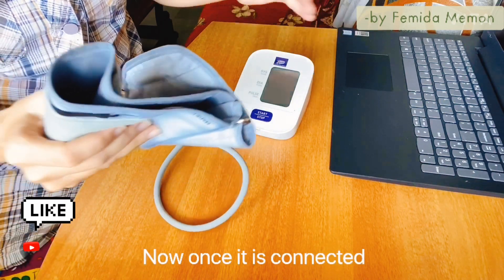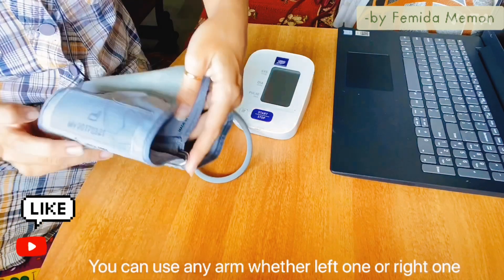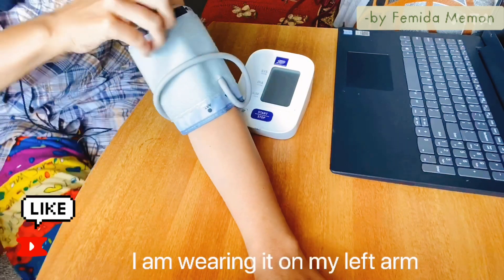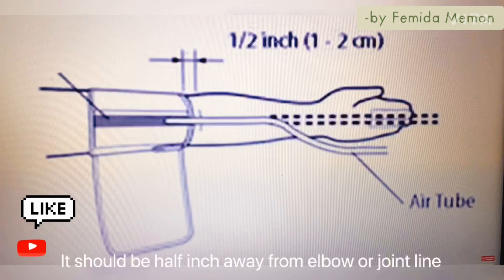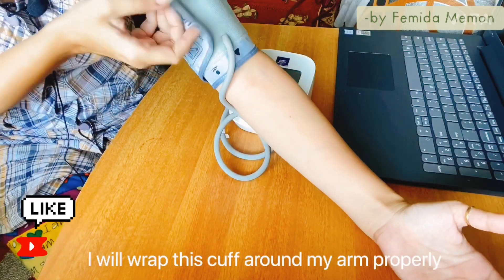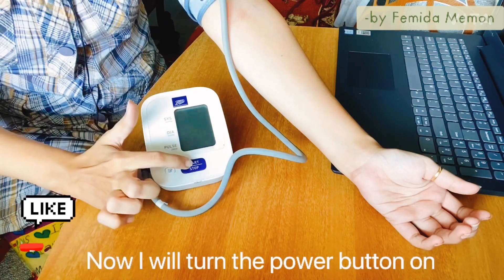Now once it is connected, remove the clothing from your arm — I have already worn a half-sleeve top so no need. I will wear this hand cuff on my arm. You can use any arm, left one or right one — I am wearing it on my left arm. You should keep it about half an inch away from the elbow or joint line, wearing it a little bit upside — around one to two centimeters. I will wrap this cuff around my arm, and the air tube should lie in the middle of your arm or forearm. Now I will turn the power button on.